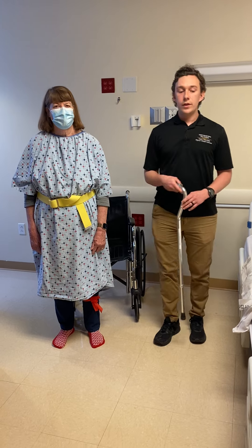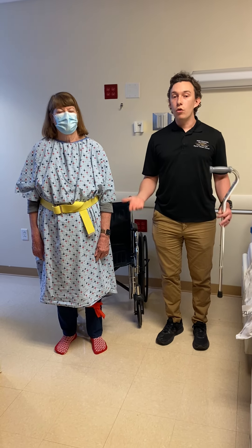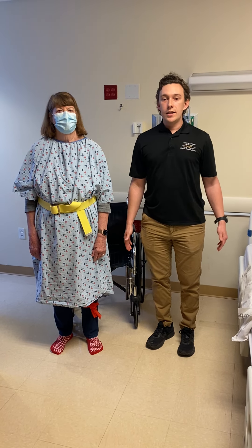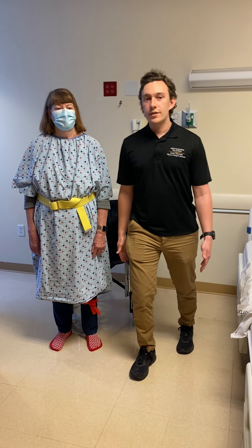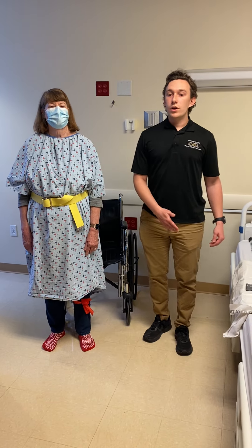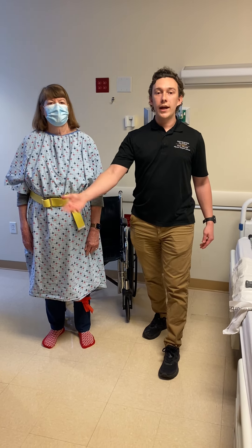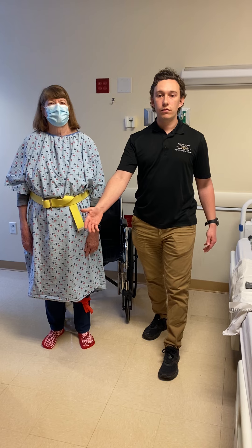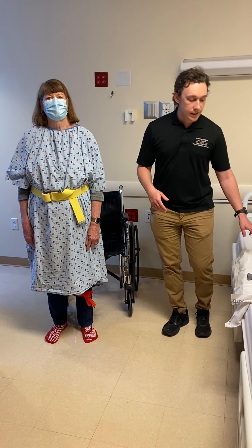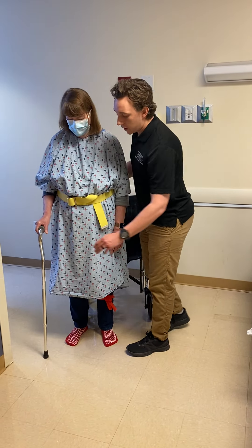Another principle is our reciprocal gait pattern — a fancy way of saying how we normally walk. Typically our hands and feet are not tied together; we are not walking in a slow motion pattern with arms and legs together, but rather they are opposite one another. As that left leg comes forward, my right arm naturally tends to go forward, and vice versa. Those two principles allow this cane to be on the right side — the patient's good side — while she is walking.